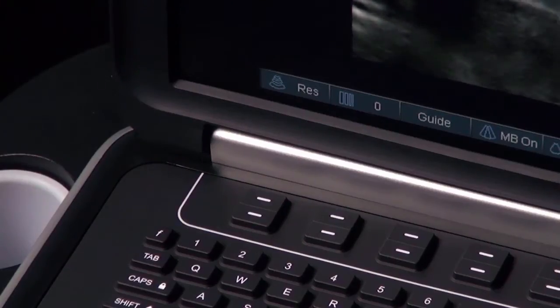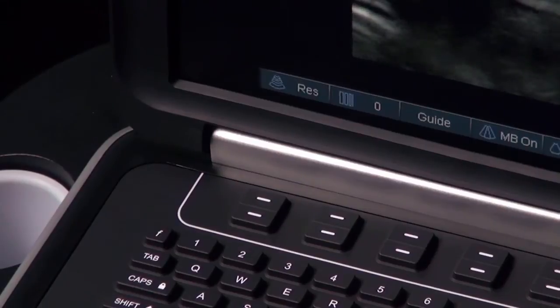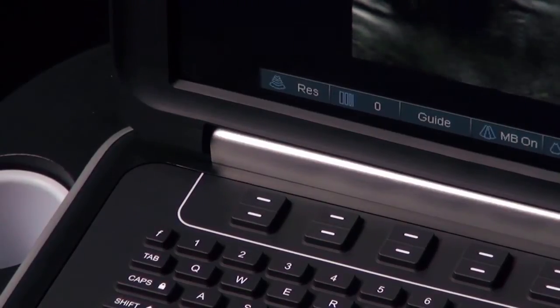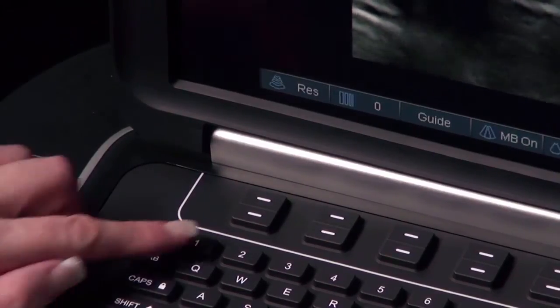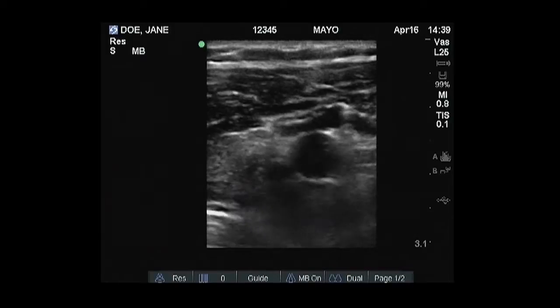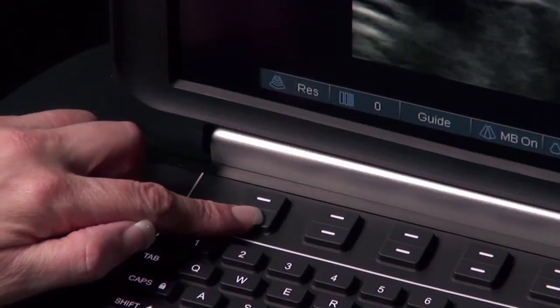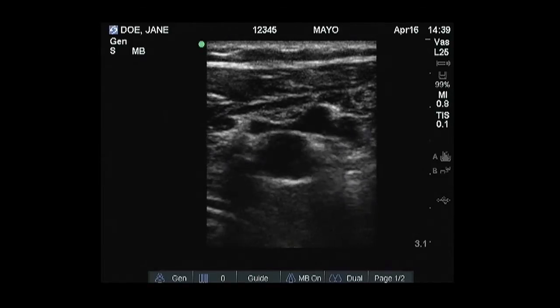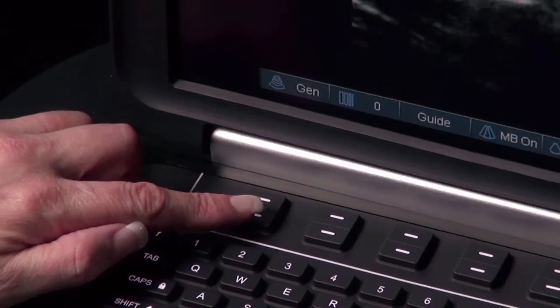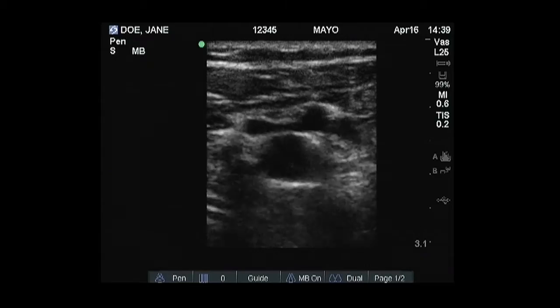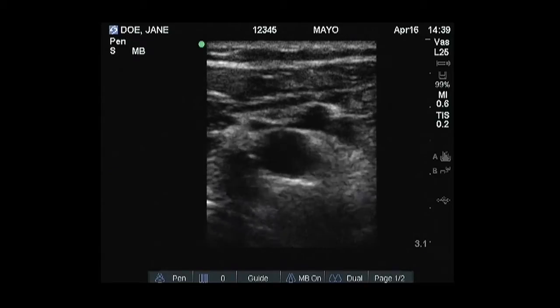Select the desired optimization setting from the on-screen menu. Res provides the best resolution possible. Gen provides a balance between resolution and penetration. Pen provides the best possible penetration.